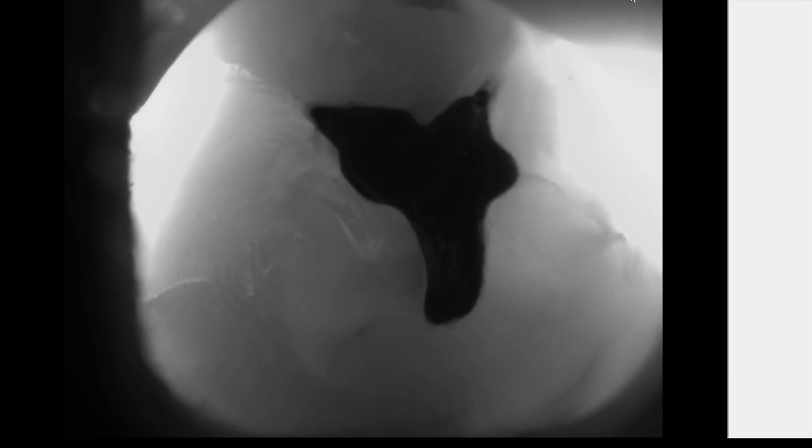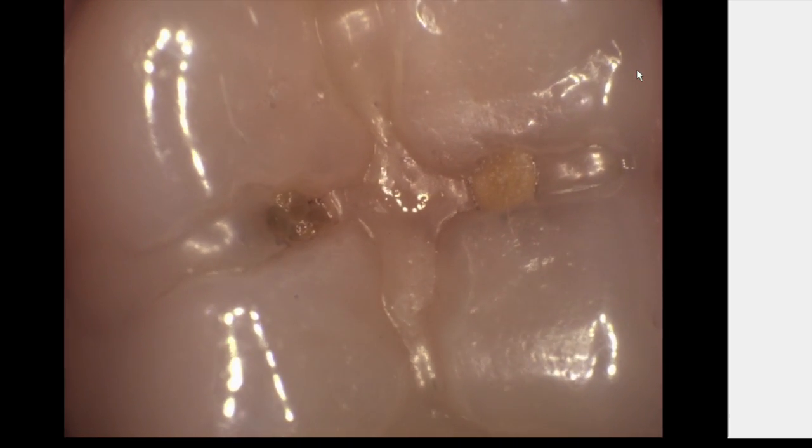That shows that there's fractures emanating from the amalgam clear through the tooth, because the light doesn't jump across those fractures. And every dentist I've shown this image to agrees that these would never show up on an x-ray, and if you can't see them, you can't warn the patient about them.